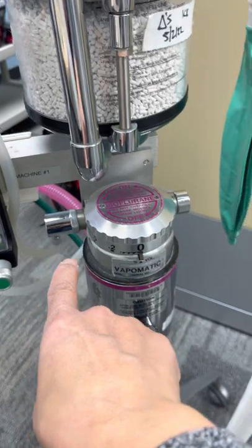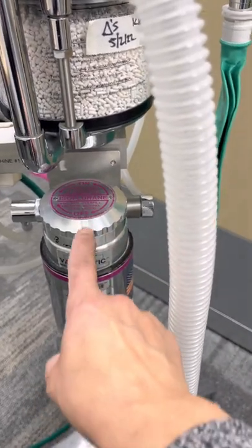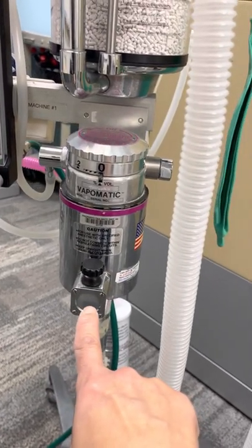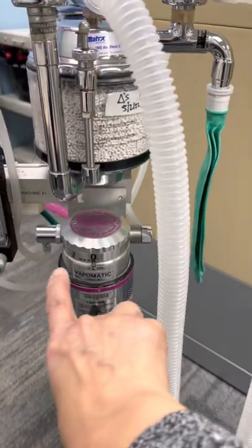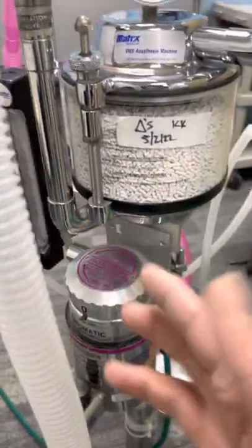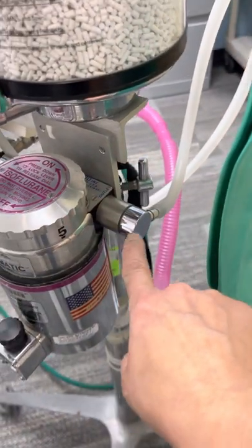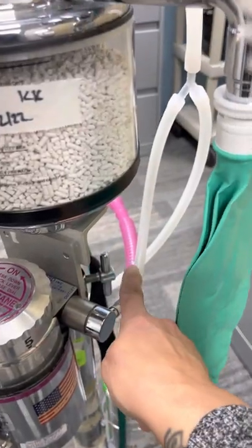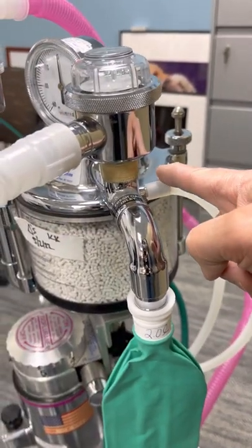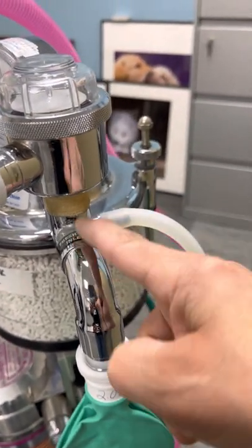Oxygen is a carrier gas, so it's going to flow over the vaporizer. This is called a vaporizer that houses our anesthetic gas, and this is isoflurane. You can see here the amount of isoflurane that's currently in this machine. So oxygen comes in, it picks up some of that gas. It's a liquid form, turns it into a gas, vaporizer. Then it goes to the outlet. If you look here closely, it says outlet. It's gonna go through this port here, and it runs up this tubing. Then, in the back here, it comes up, and this is the fresh gas inlet. So this is brand new gas, it's fresh gas, it's gonna come up.